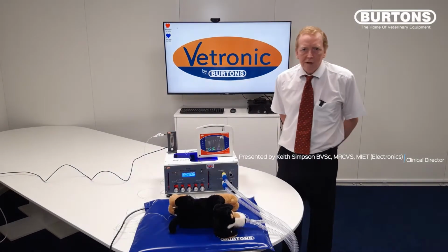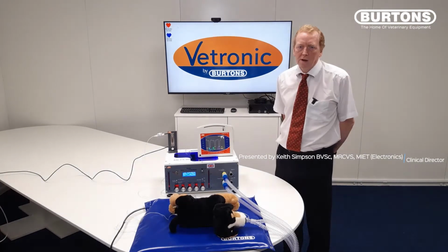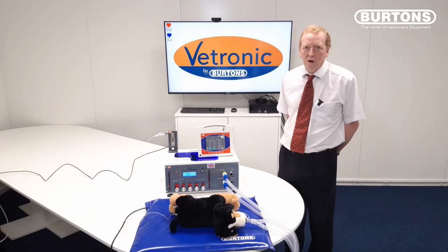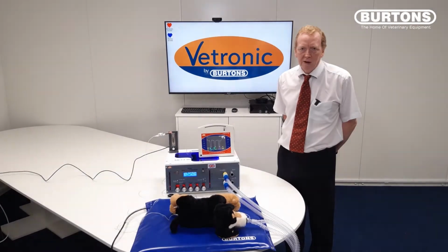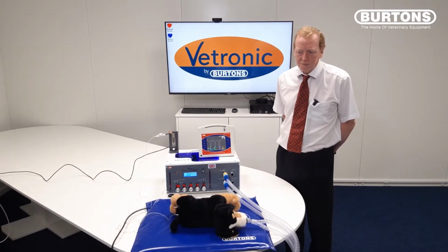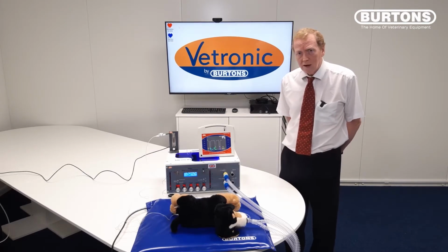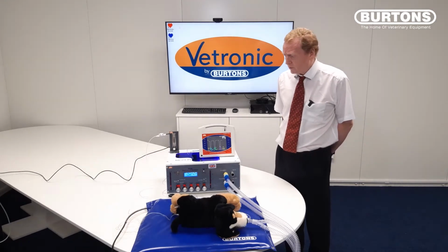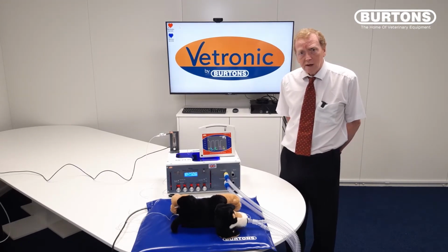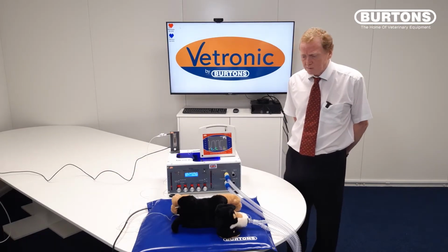Hello, my name is Keith Simpson, and in this video I'm going to introduce the Annequin simulation model for simulating CO2 breathing in animals as a means of training or learning about capnography in general. And we're going to use a setup here that incorporates a ventilator, a capnograph, and an introduction of some CO2 to simulate the breathing of this animal.